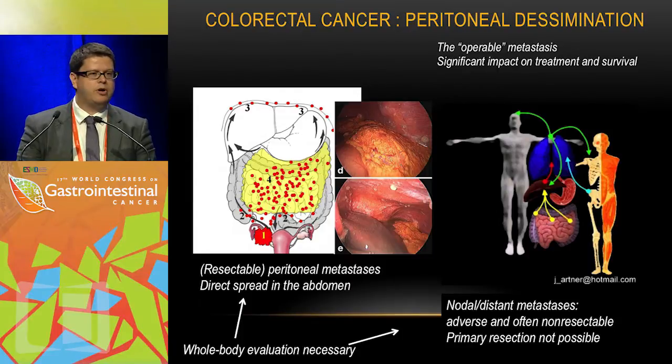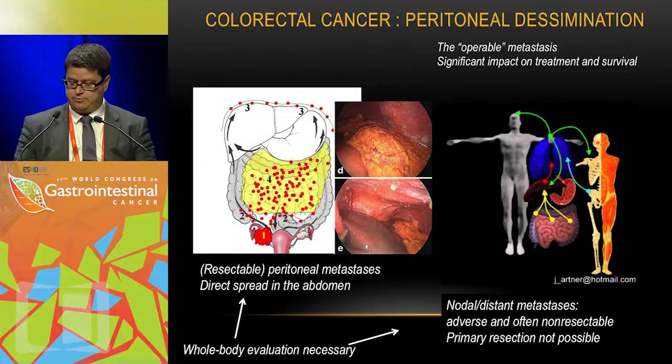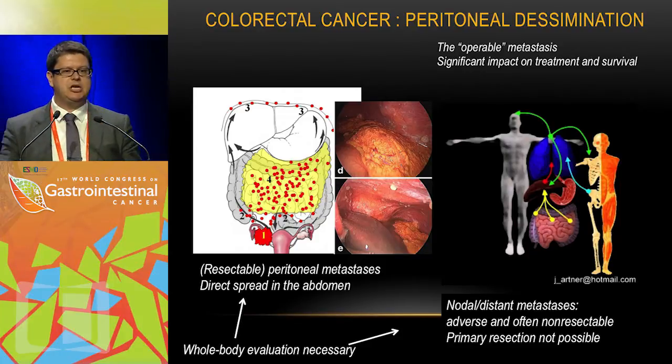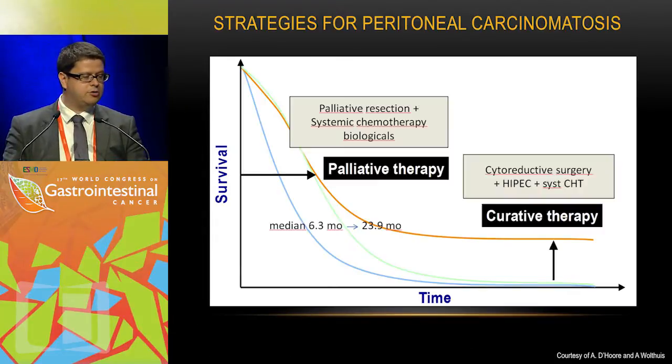We make extreme progress, but in the peritoneal cavity with the current modalities, be it conventional MRI, CT or PET-CT, it is still very difficult to do a very good preoperative evaluation of these patients. One of the examples is this: we always say CT is cheap. Actually, we can apply it very easily, but if you would put the cost of the CT against the efficacy of predicting operability of the patient, probably we have a problem with applying these diagnostics.